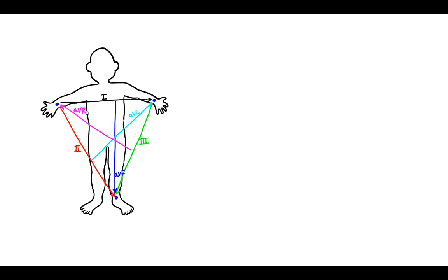And this can seem kind of scary, but you can appreciate that because the arrows are pointing in all different directions, there are many different viewpoints about which we can look at the heart's electrical activity. And so the heart could have charges moving in many different directions, and if it's moving in a certain direction, it's almost certainly going to overlap with one of these leads and get at least one of them to become excited. So that's very good.